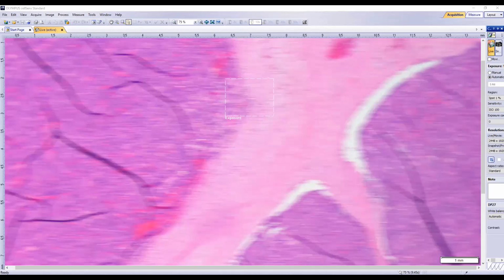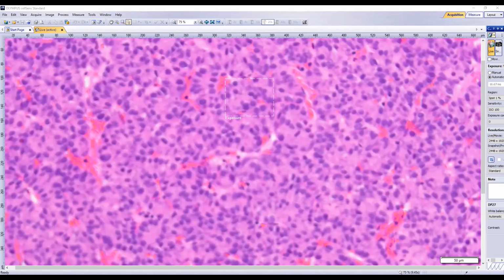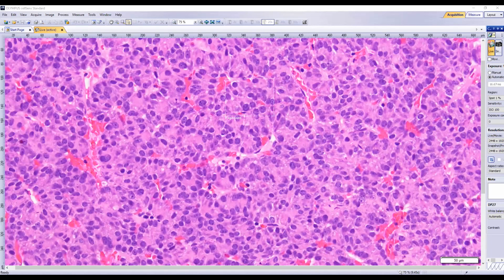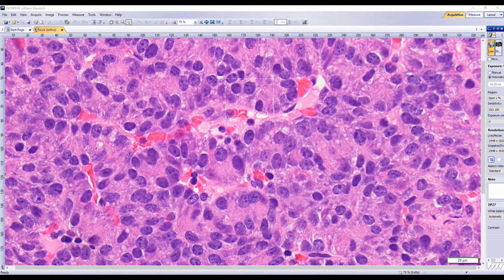And they got some cells. This is how the tumor looks. I won't say what it was called, but I just want you guys to look at the morphology and appreciate what it looks like from low power or high power.